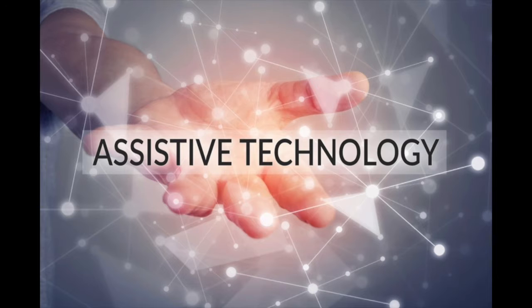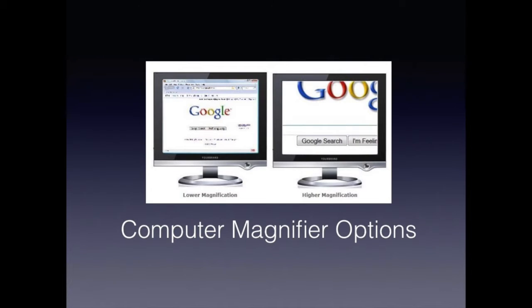Assistive technology. Hello and welcome. Today's topic is computer screen magnifiers. What is a screen magnifier? It is a device that magnifies the computer screen so it can be used comfortably, lessen eye strain, and prolong computer use. There are two types of screen magnifier.